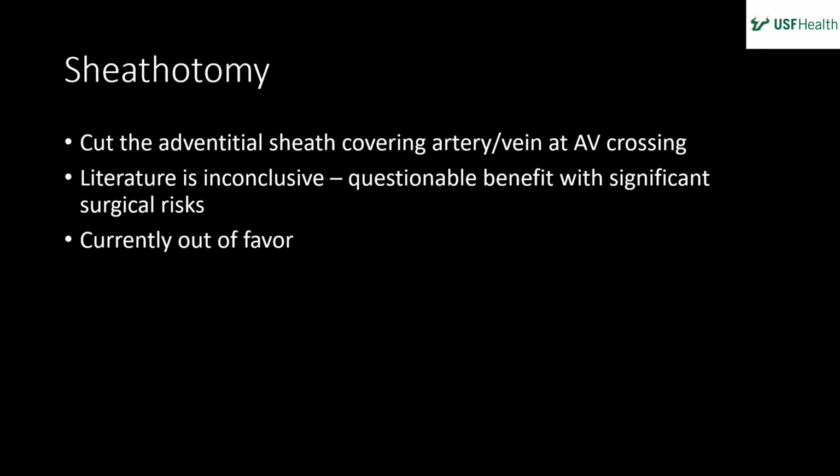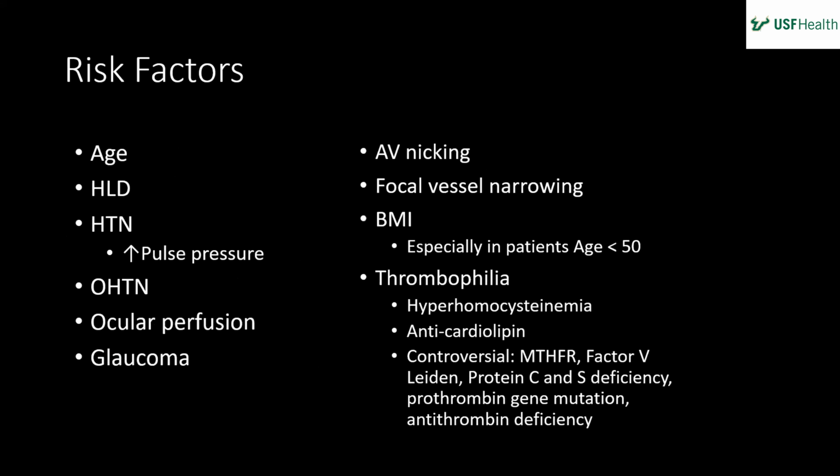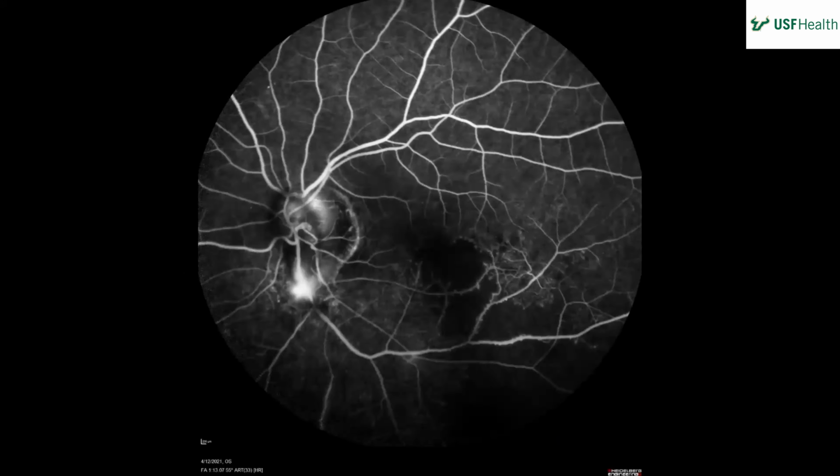Did she have vitreous heme? A little bit, not much. I think it's just neovascularization. So what was all the hyperreflectivity on the OCT? I think it was subclinical hemorrhage. Okay, it had to be. So did you send her for a workup? No, I don't work up branch veins because I just don't think it's necessary.